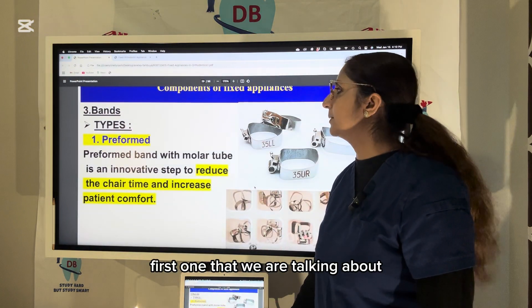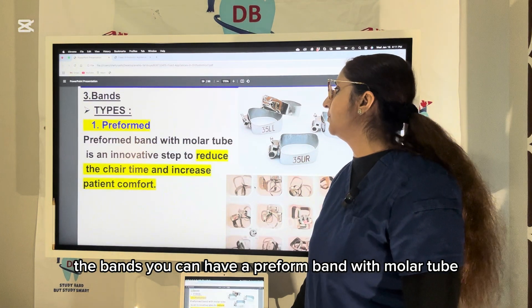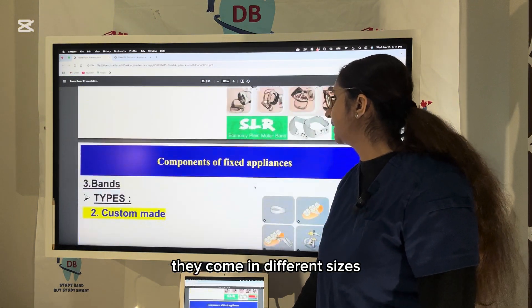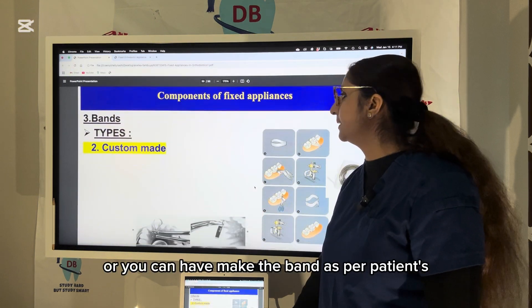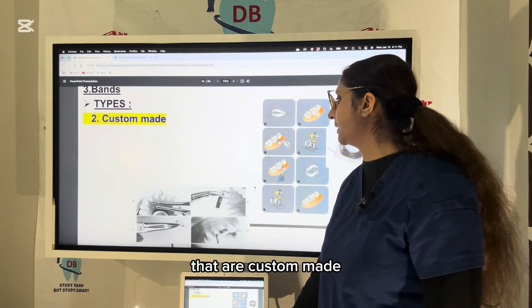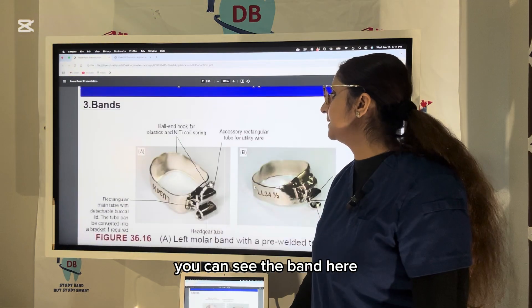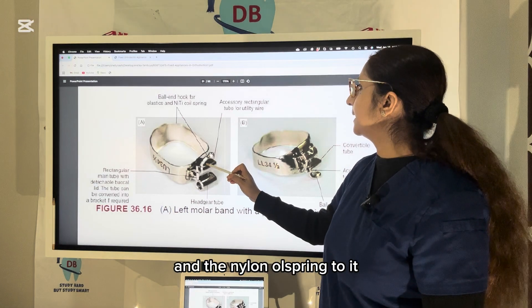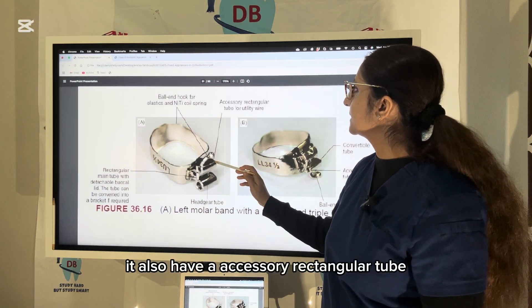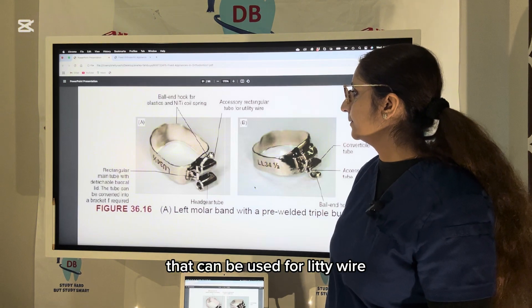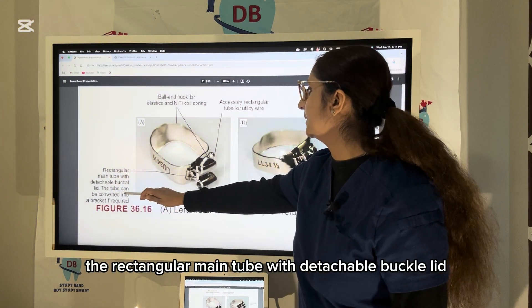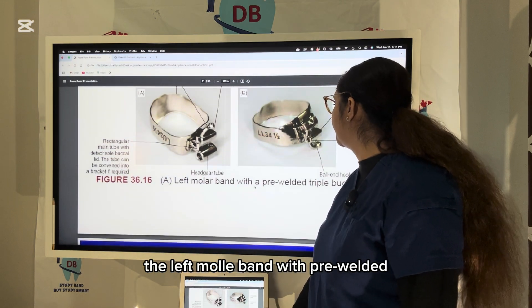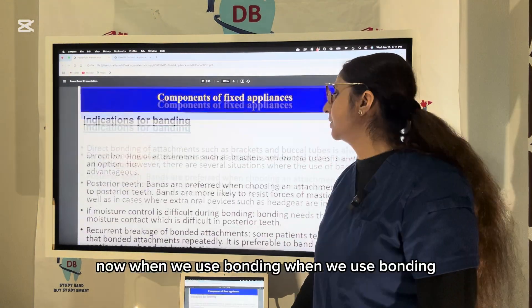Preformed bands with molar tubes reduce chair-side time and increase patient comfort. They come in different sizes, or you can make custom-made bands as per the patient's tooth circumference, though custom-made bands require more complex steps. The band has a ball hook for attaching elastics and NiTi springs. There is also an accessory rectangular tube for utility wire and a rectangular main tube with a detachable buccal tube lid that can be converted to a bracket if required.